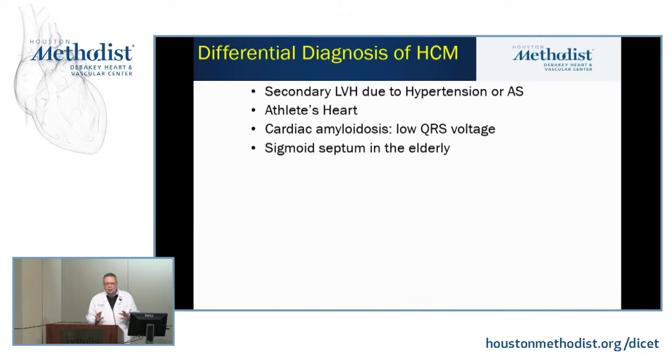And this is an important thing because we see a lot of these patients every day, and echo looks like hypertrophic cardiomyopathy, and the majority do have it. However, we also occasionally see little ladies that have had a long history of hypertension, and now they're 82 years old, and they have a hyperdynamic heart, and they come in febrile with pneumonia, and lo and behold, they got a big-time gradient.